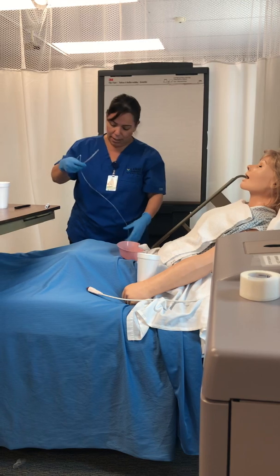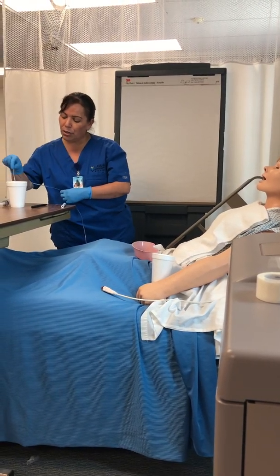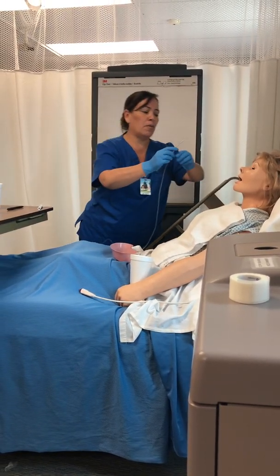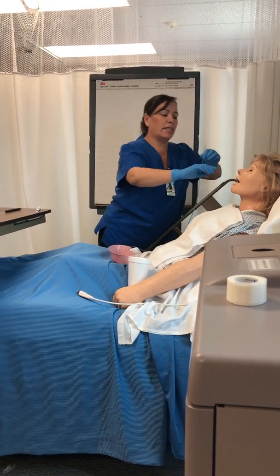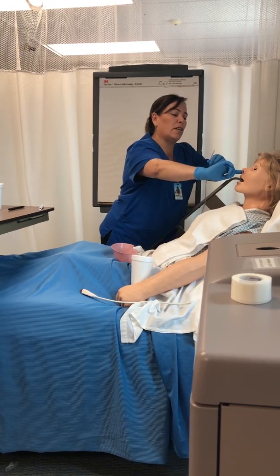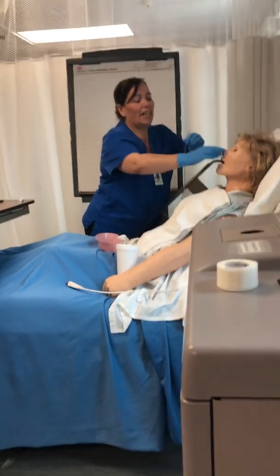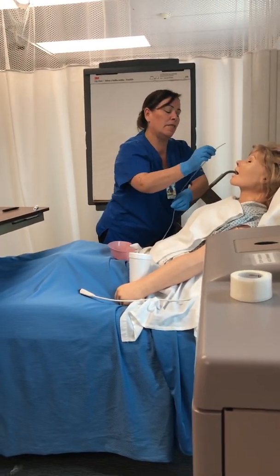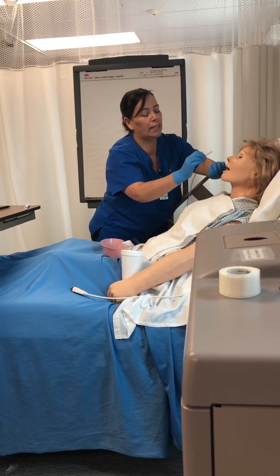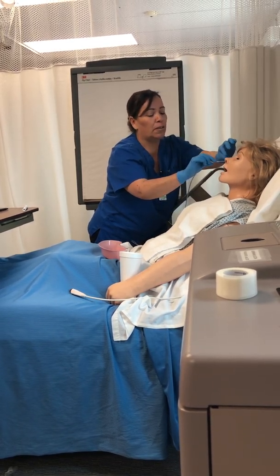I'm gonna proceed. So then you lubricate the tubing 3 to 4 inches with room temperature water. Then you ask the patient to occlude each nostril, so you check the right side, then the left side. So the right side is the good side for the tubing. You instruct the patient to relax and breathe slowly. So I'm gonna insert the tube.